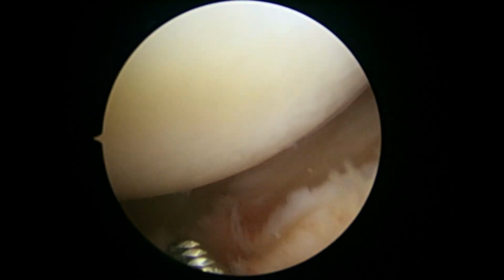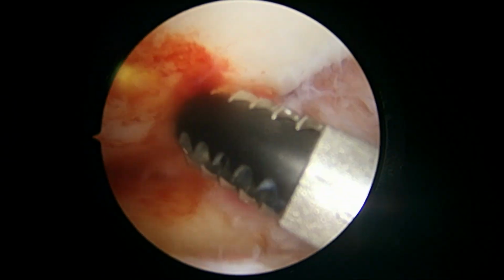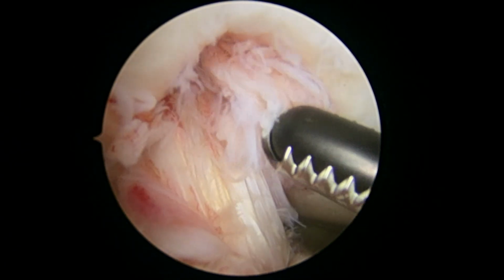Okay, so we got one. We'll continue our little hunt here. Don't see anything else right there. We'll look in the central part of the knee. This is where you had the old surgery. And that looks good.